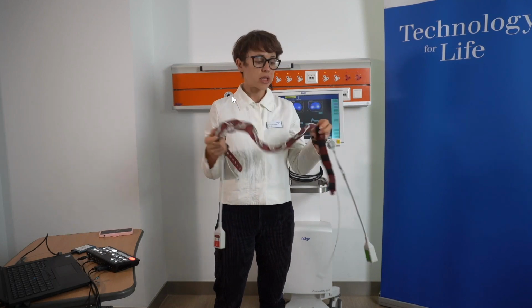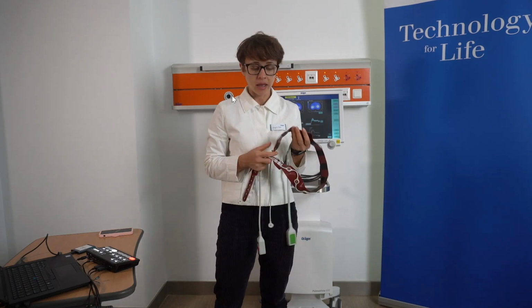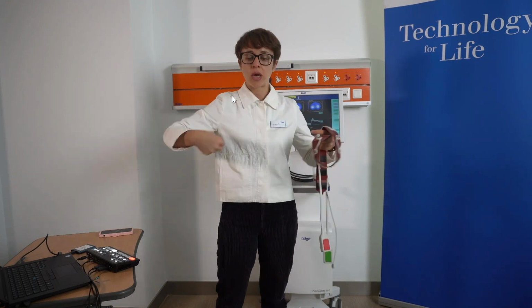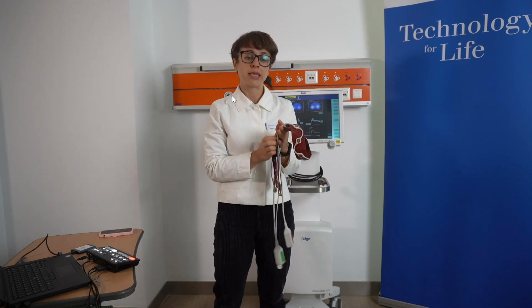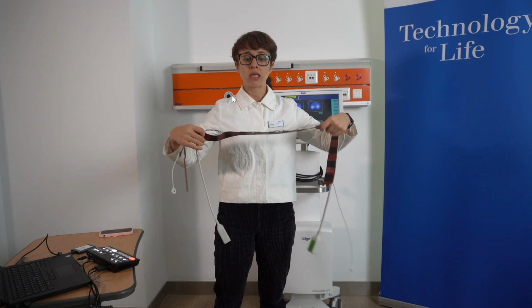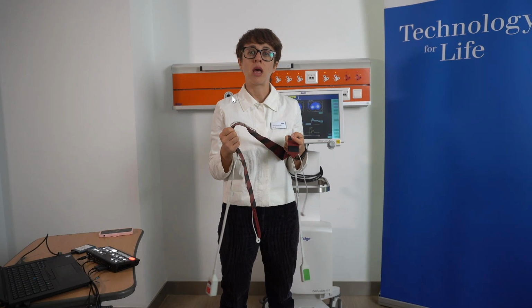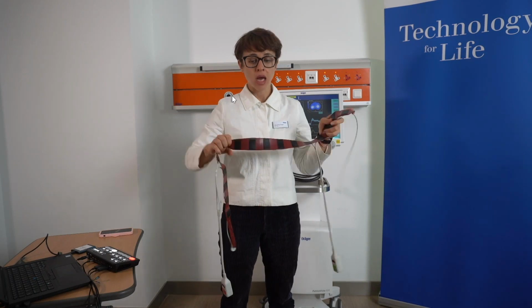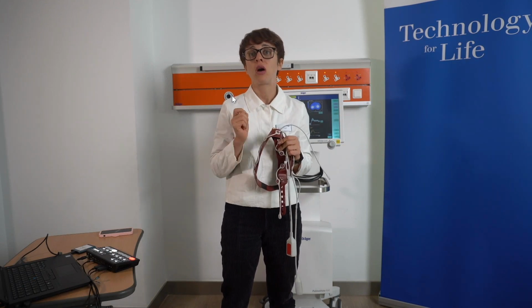We have sizes from the smaller ones, XS, to XXXL. We have a measuring tape that you can use to measure the chest circumference of the patient and find the optimal size. The belt needs to be positioned tight enough to get a good signal, but it should not be the case that your patient is squeezed by the belt, because in that case, yes, it will have an impact on the thoracic compliance.